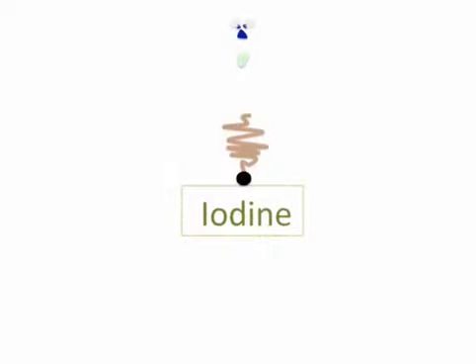So how do you tell if there are lung mets? The trick is basically this. If you can see the heart shadow through, like it looks like an outline of the heart, you can actually make that out on the background of the lungs, then you have lung mets. Because you're dealing with micro metastasis, you're not going to see blotchy, discrete mets a lot of times. They're not going to be focal. But if you can see the outline of the heart, then you have to call lung mets.